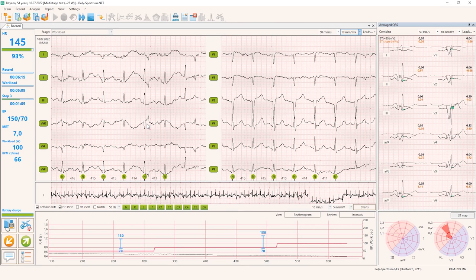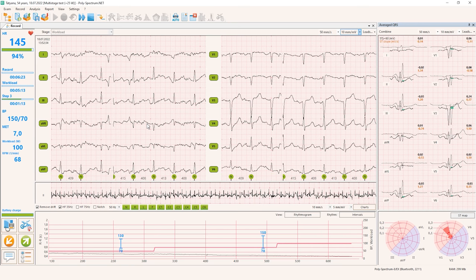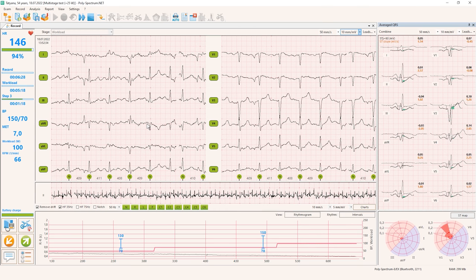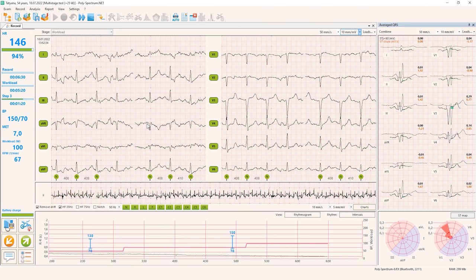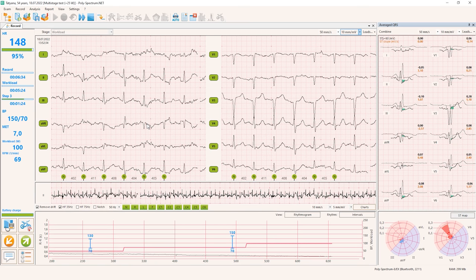But when your patient starts to feel that the exercise is not very comfortable, it's not an easy ride, the patient starts moving the body, and this makes more noise on the ECG. Yeah, for sure it's better to use some filtering.